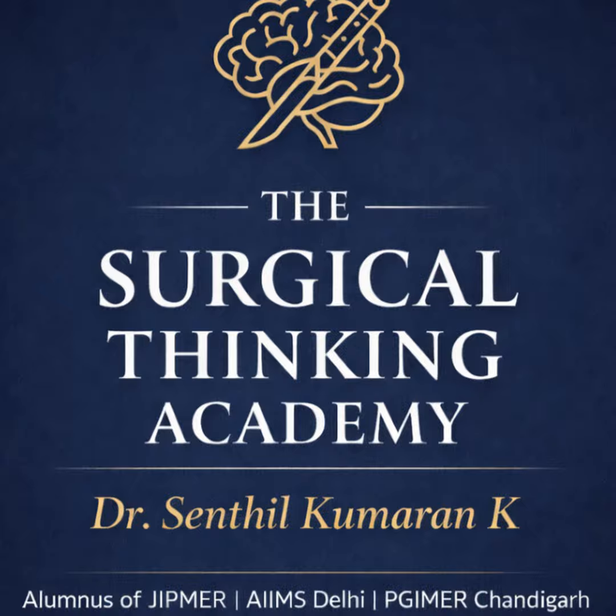We do. If you have a lesion larger than 1 centimeter in a cirrhotic liver, and it shows that specific arterial enhancement and washout, you do not need a biopsy. The imaging is considered diagnostic. Which is just wild when you think about it. We're starting chemotherapy or scheduling transplants based purely on a picture.